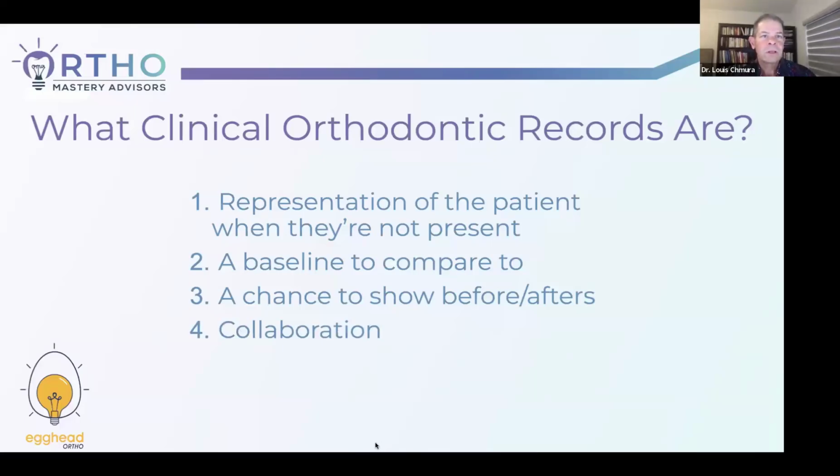And the fourth one is collaboration. With all the electronics that we have, and in fact, OrthoFX has a collaboration platform that I work with. I'll show you some of the cases I'm working on that platform, where you don't necessarily have to be in the same room, same town to work out cases.